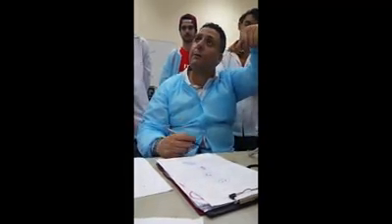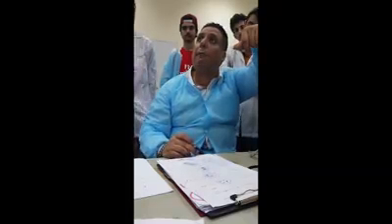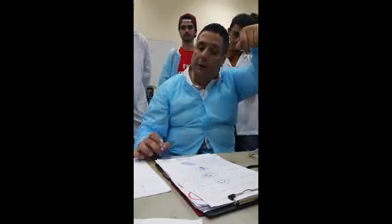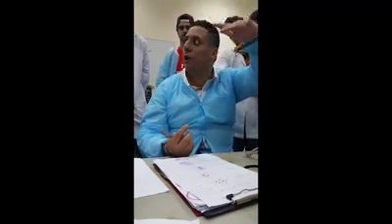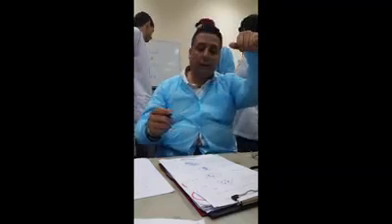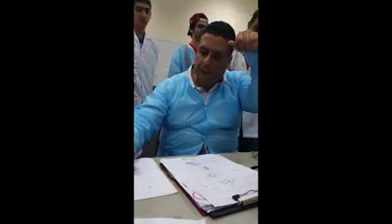Sometimes people get confused between the basophil and the monocyte. How do we distinguish between them? In the references, they say the monocyte looks kidney shaped, like a kidney. The kidney is behind me, I can't bring it. So kidney shape, like this.